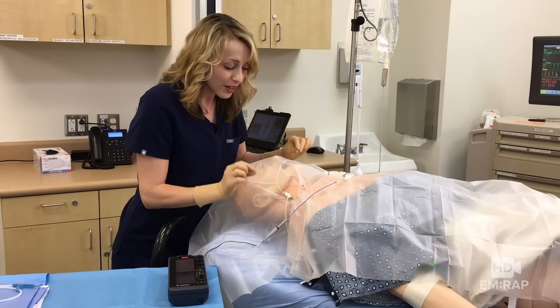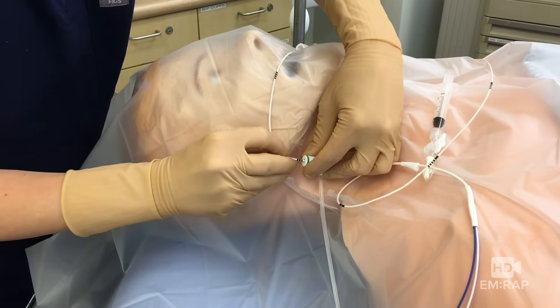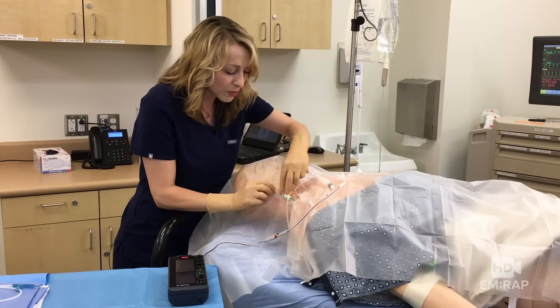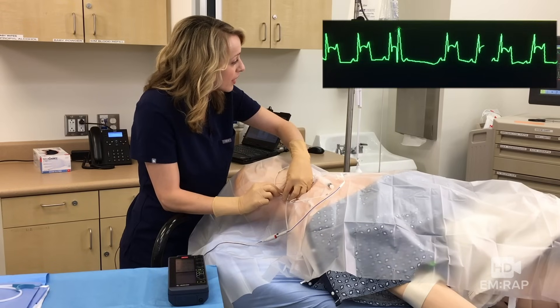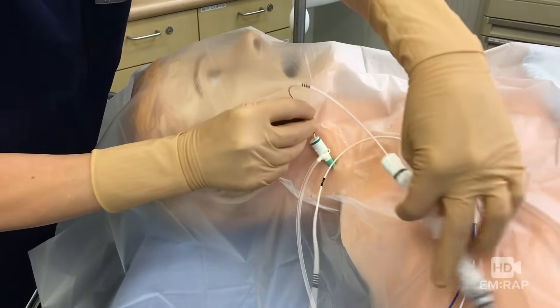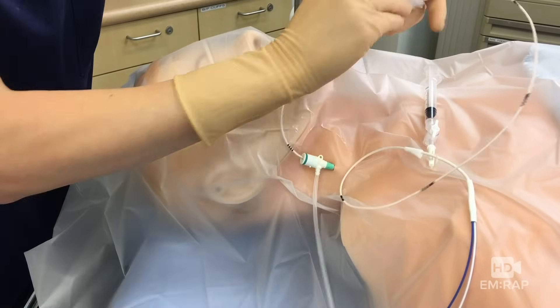Insert the wire a bit further to float the balloon in — push it down to the 30 centimeter mark, indicated by the three black lines on the pacing wire. Now inflate the balloon and advance another five centimeters or so. As you do this, watch the cardiac monitor for that injury pattern that looks like a STEMI in lead V1 — that confirms you're in the RV, and you can confirm on ultrasound if available. If the wire coils up in the RA, back it out, rotate, and re-advance to direct it into the RV. Once you've got it, confirm mechanical capture with palpation of the pulse or pulse ox.